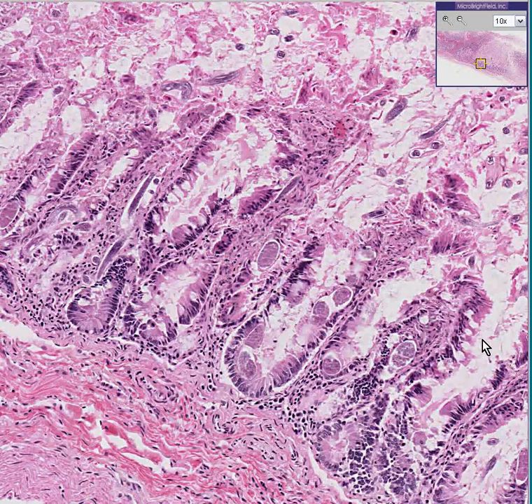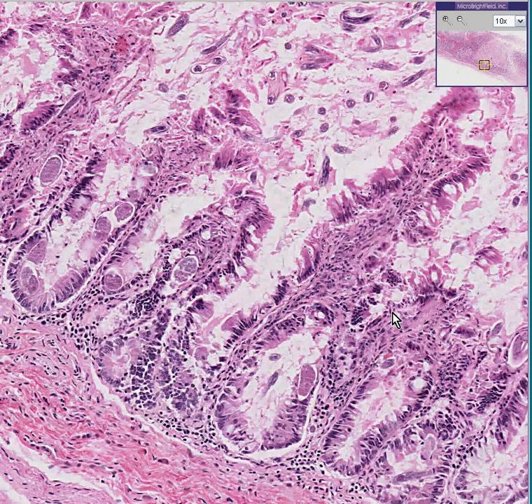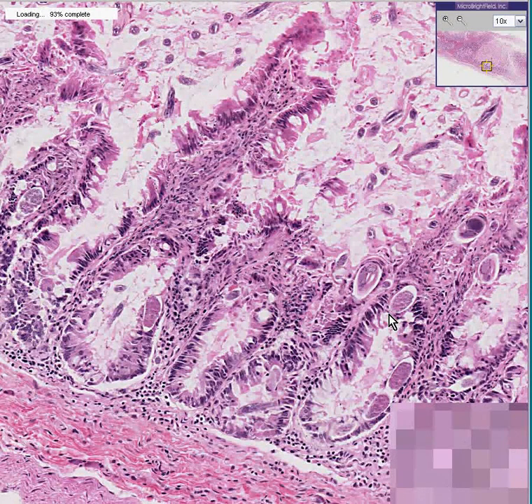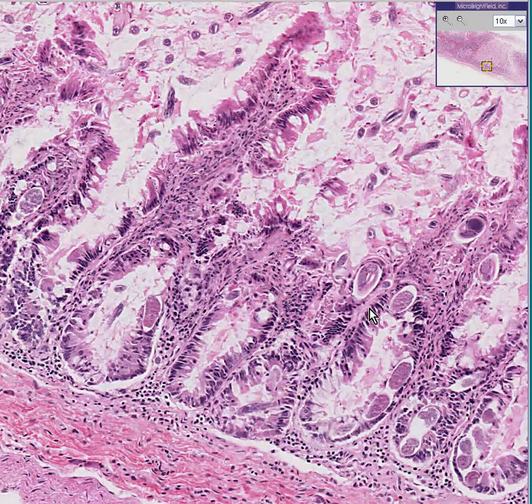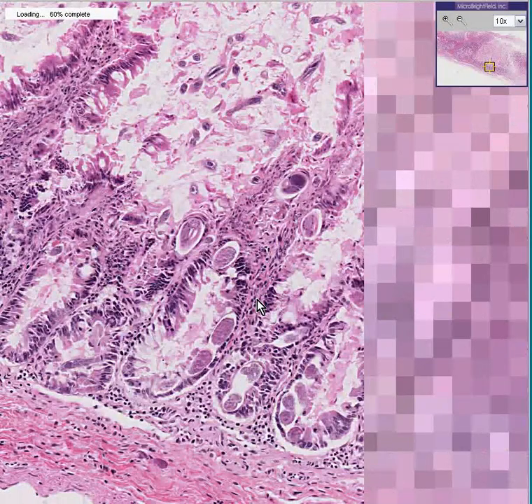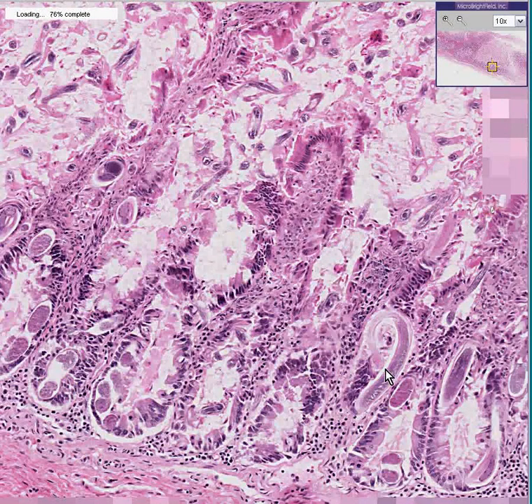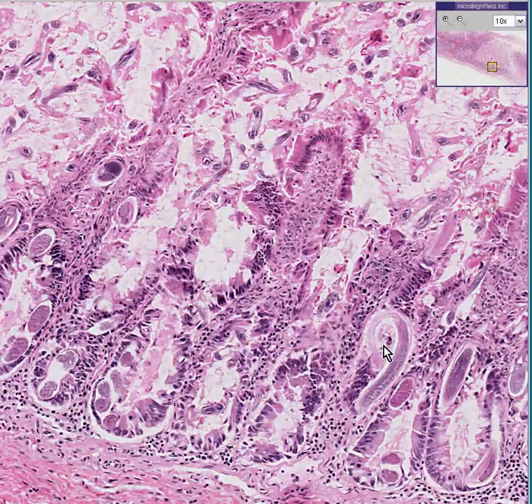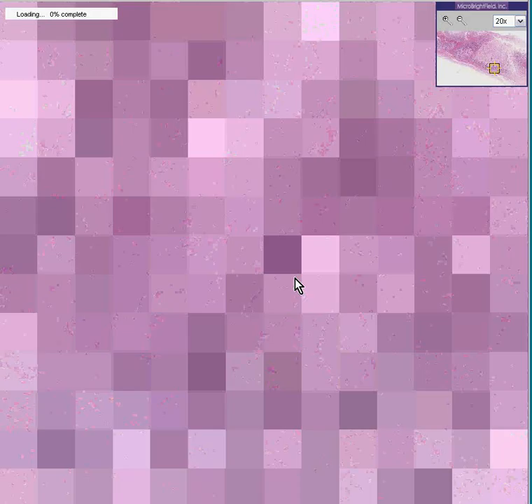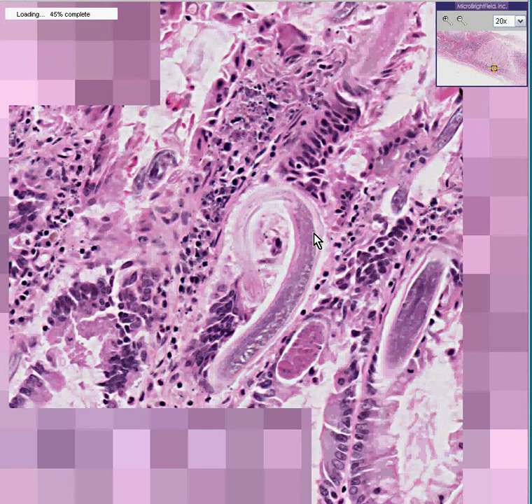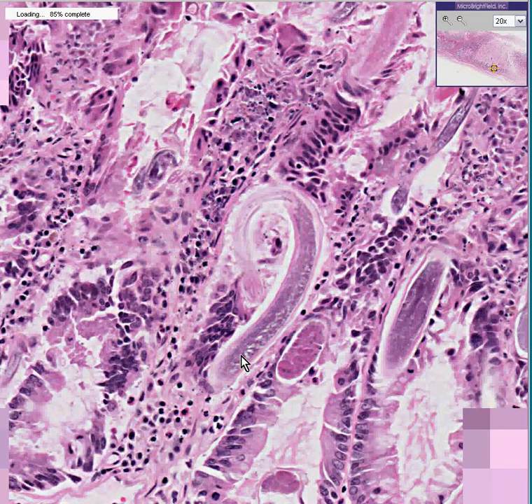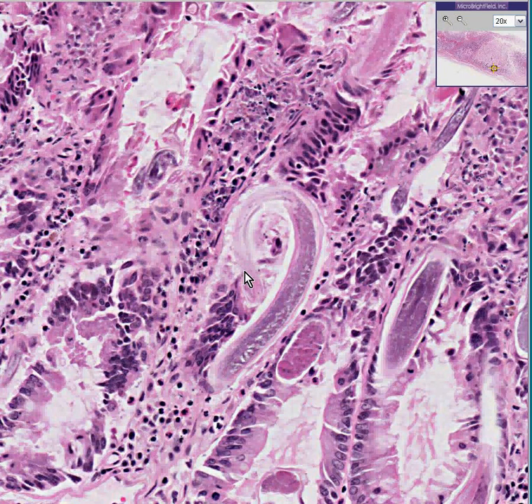These are larvae of the worm Strongyloides stercoralis, the most common type of roundworm affecting the bowel. As you can see, it could more than be in the bowel — it could actually invade into the lamina propria of the mucosa of the small bowel. Here's almost a whole worm; look how it's kind of spiral. In this area, it's not just a cross-section — you're actually looking at almost a full longitudinal section of the worm with secondary structures in between.